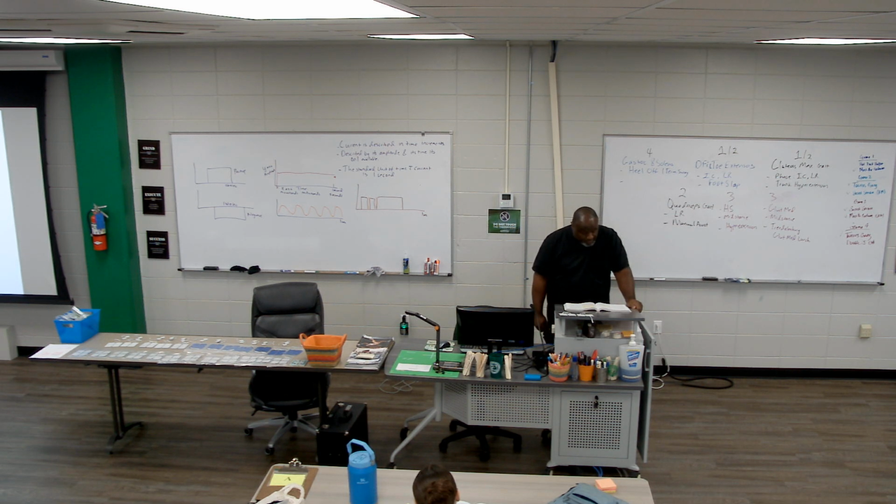It says preferences for different types of E-stim can also vary in different muscle groups. Clinicians need to be mindful of the outcomes, and remember, patients do not understand the rationale a lot of times. They just want to be comfortable. Okay? So, waveform selection. This is the next paragraph that's good. All waveforms are basically effective at activating peripheral nerves.